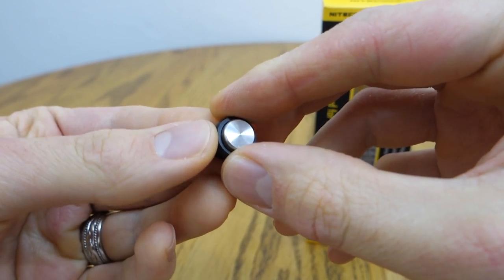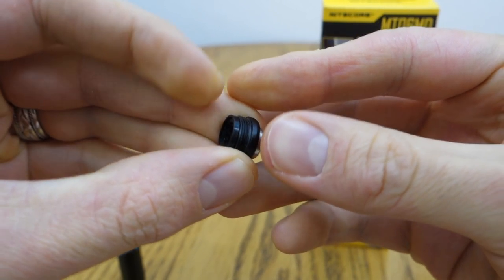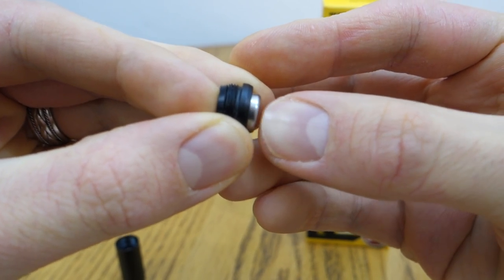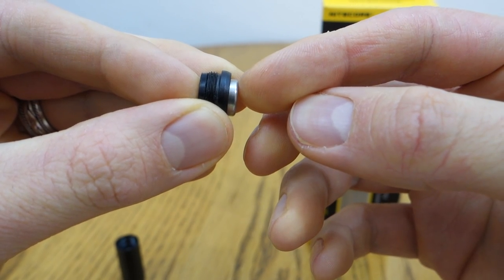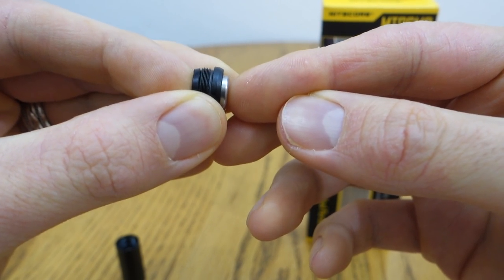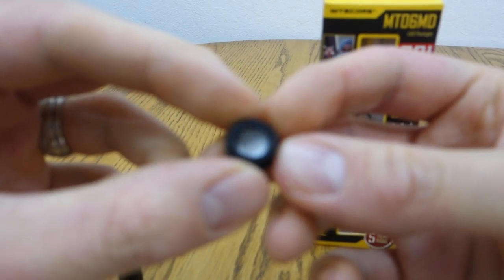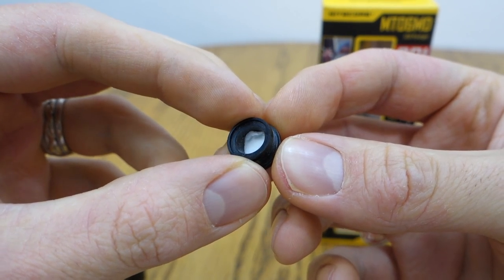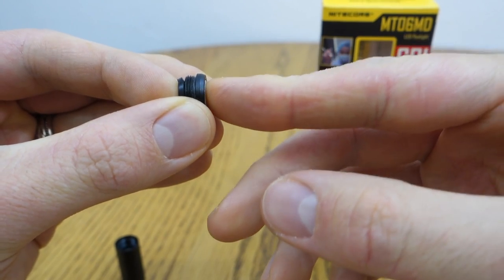Regarding the switch cover, it has a decorative stainless steel cap with a rubber boot underneath, which makes it bounce and keeps it above the switch. I found there was too much wiggle in there, so I actually just added a little bit of tissue and packed it in so it was a little tighter and there wasn't too much range of motion.